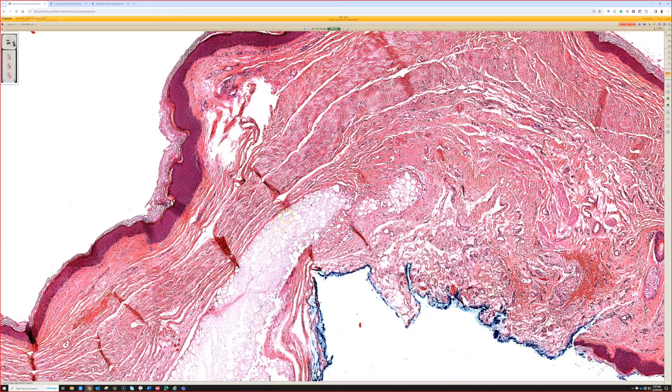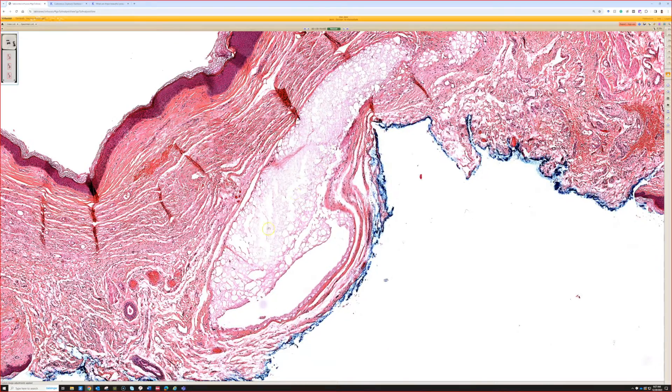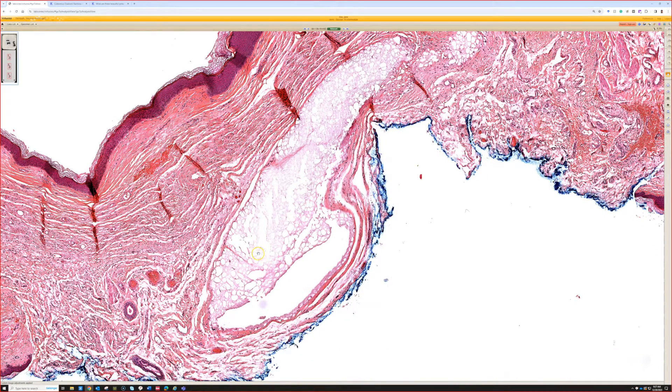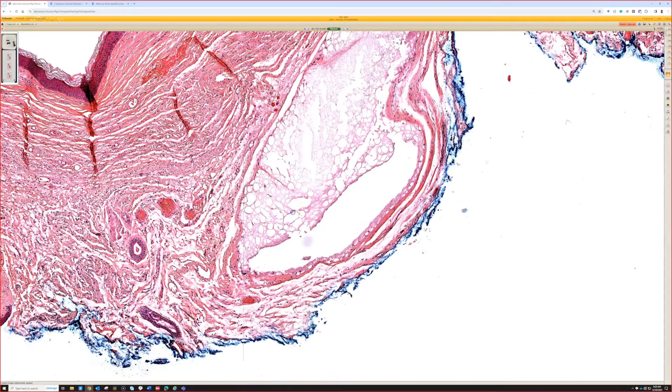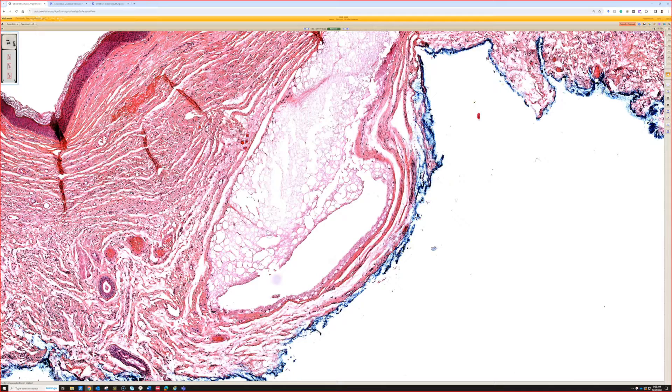So once you've seen it a few times, it's pretty characteristic. It kind of has a pale pink to gray to blue appearance, depends on the H&E, and it's very bubbly because this is injected steroids.